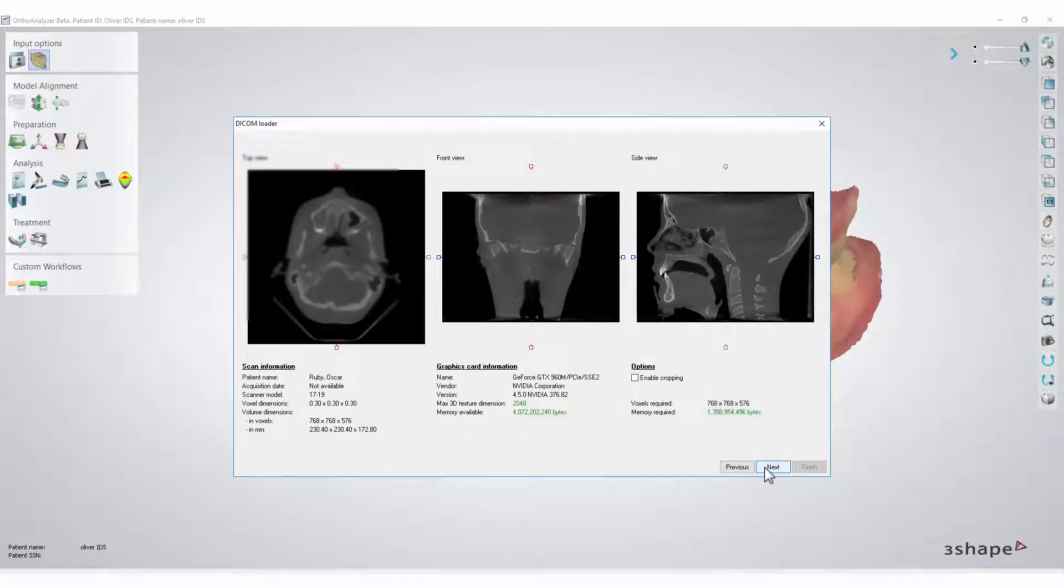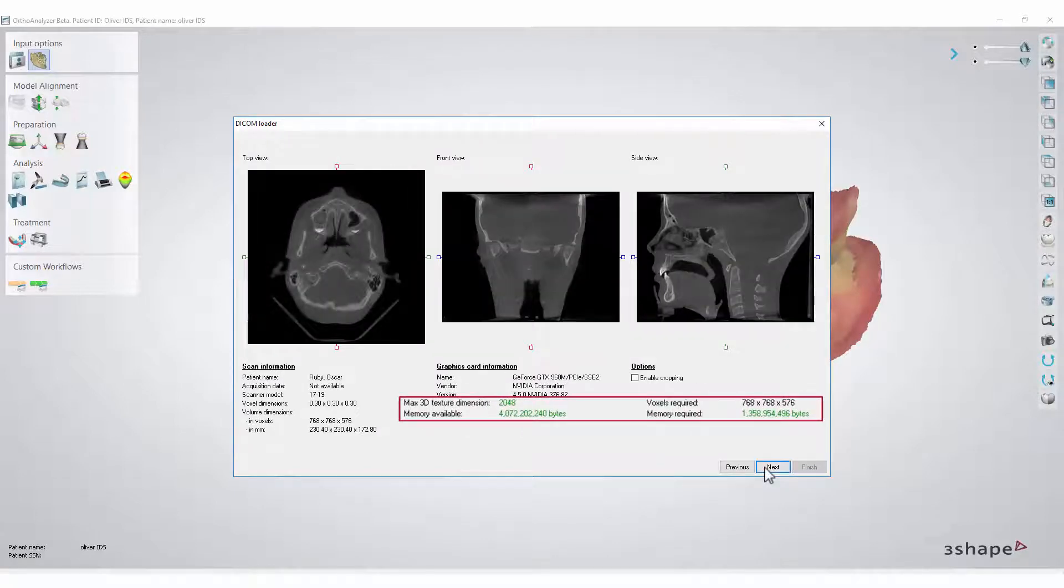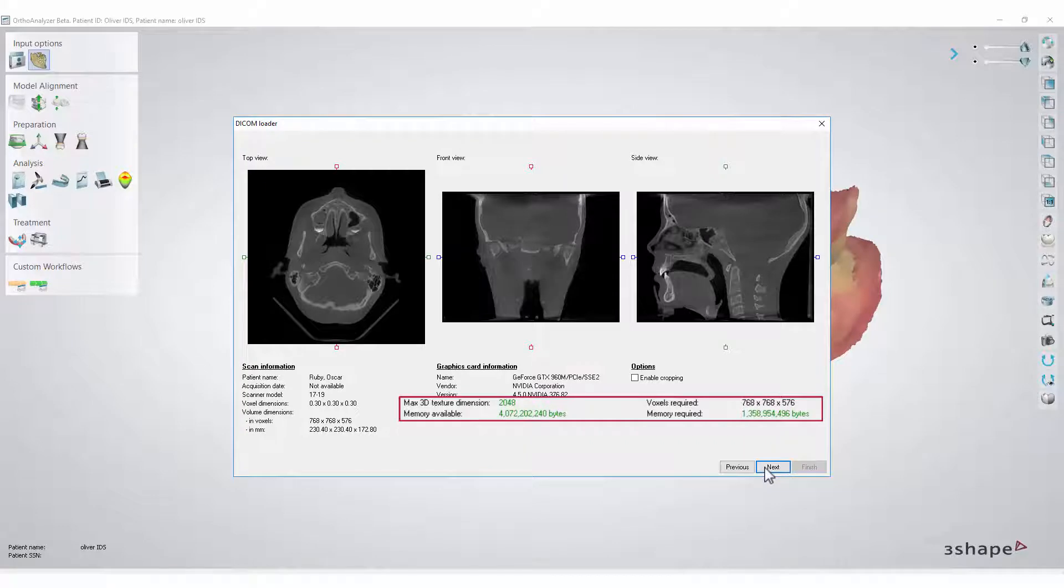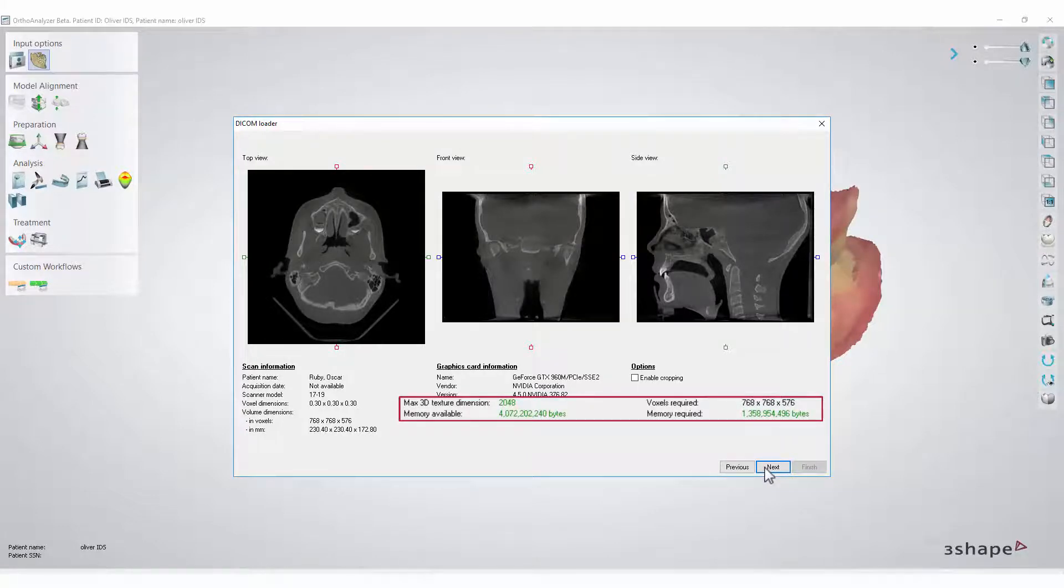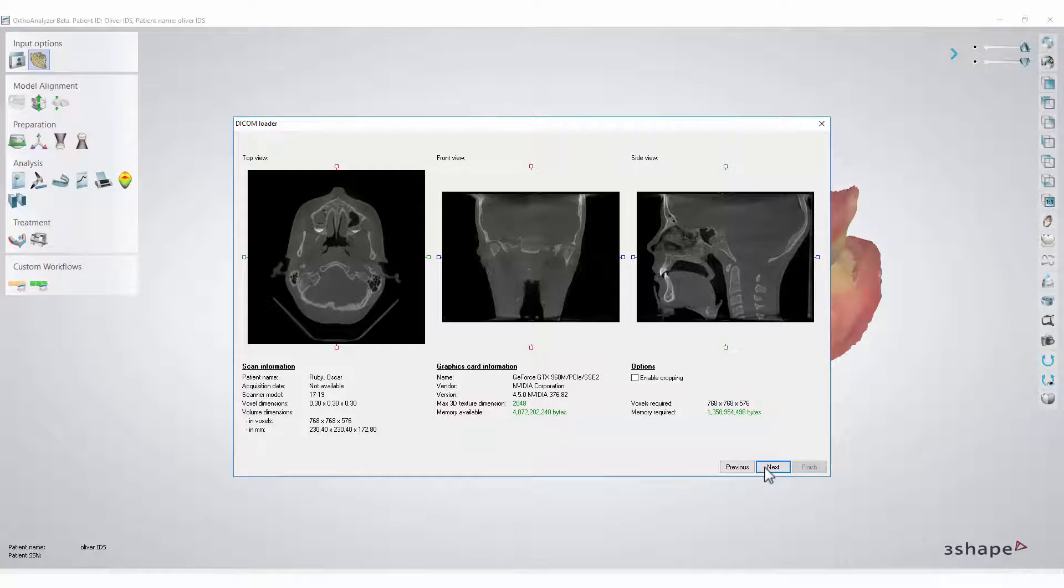It is very important to pay attention to the required numbers. They must be green. If they are, this means the size of the chosen DICOM scan is good enough. If they are red instead, you must crop the image until the numbers are green.